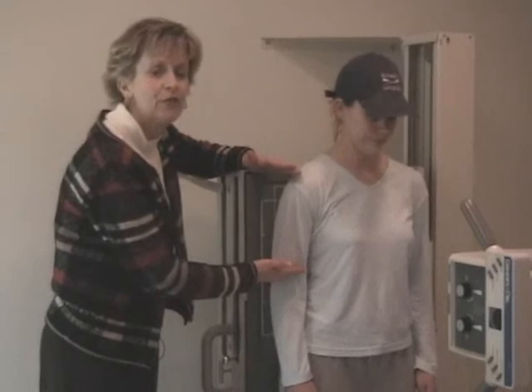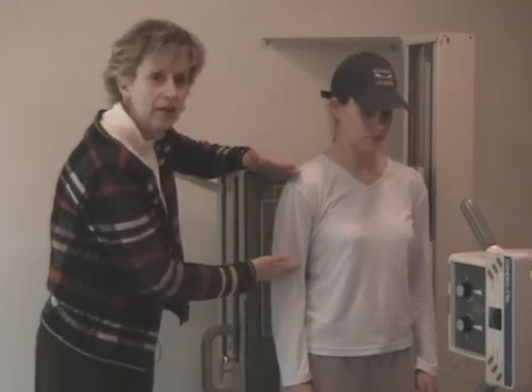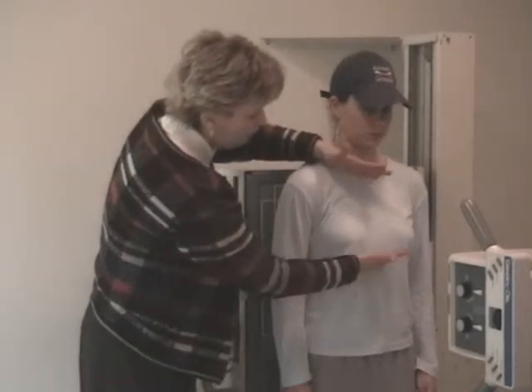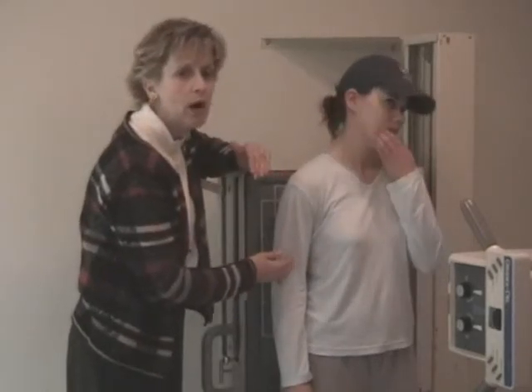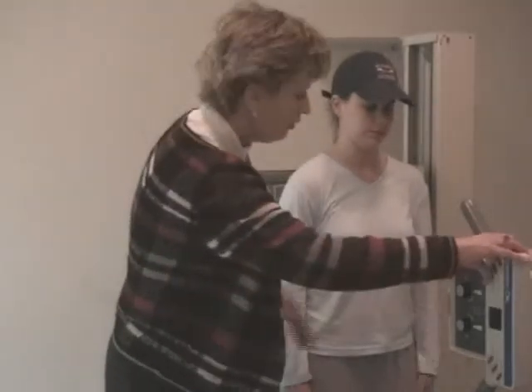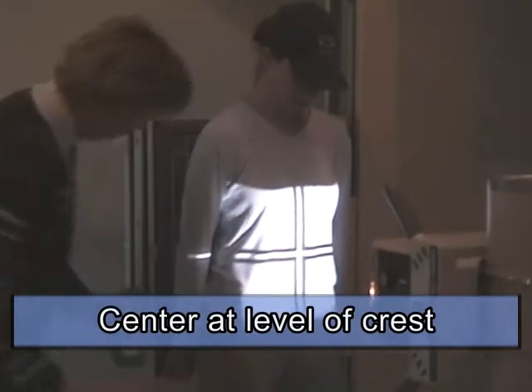This projection is after the abdomen. And if you are afraid of clipping the diaphragm, and so you compensate by raising the film, you actually have half of your film over her lung now. And that's what we don't want. So an average patient of height, again, center at the level of the crest, so you get more abdomen on there. But utilize the tricks to image the chest to make sure that the diaphragms are up at the upper level. Now again, I will stress the breathing of the upright abdomen.